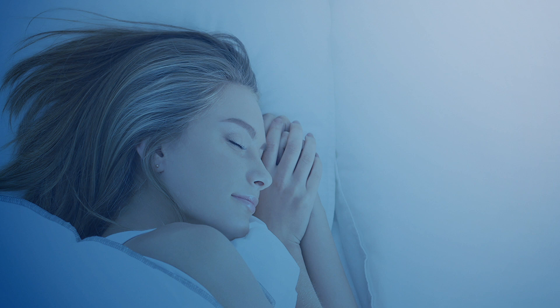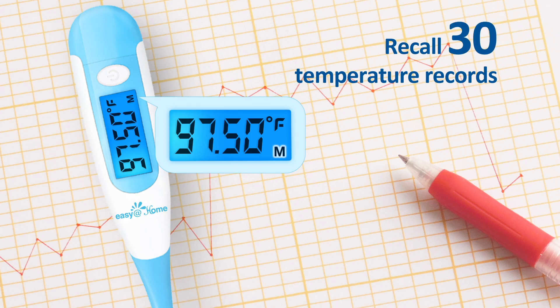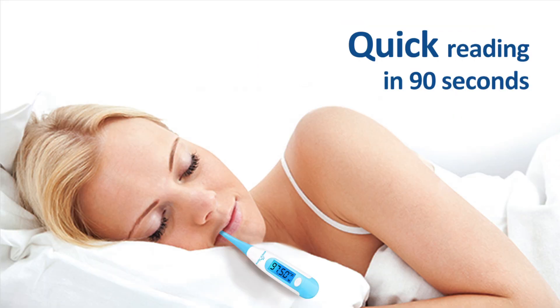This digital basal thermometer has a large blue backlit screen and can recall up to 30 temperatures in memory. Unlike traditional thermometers, the EBT-100 digital basal thermometer can measure basal body temperature to 1/100th of a degree. To ensure precision, measurement usually takes about 90 seconds.